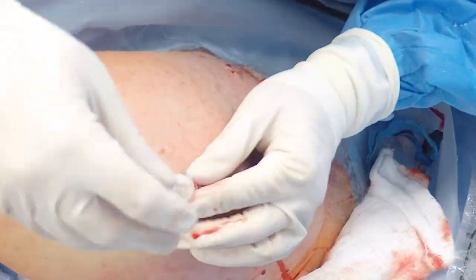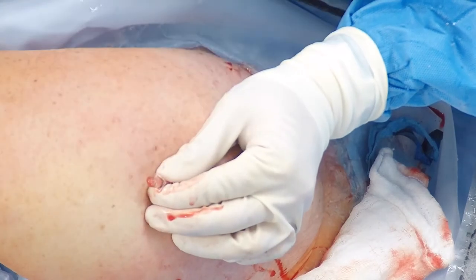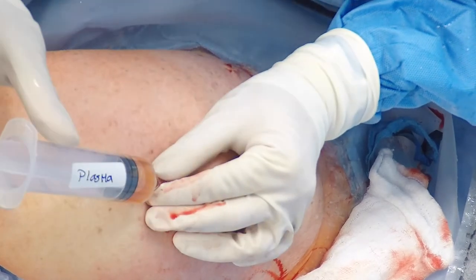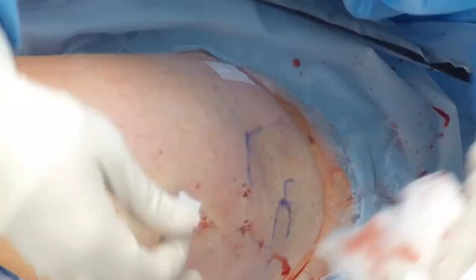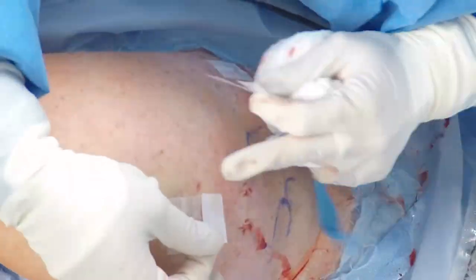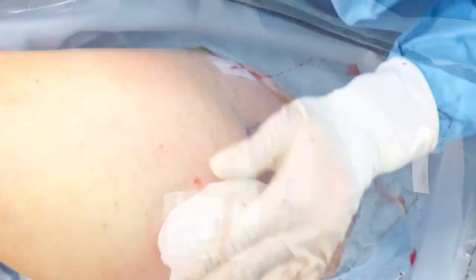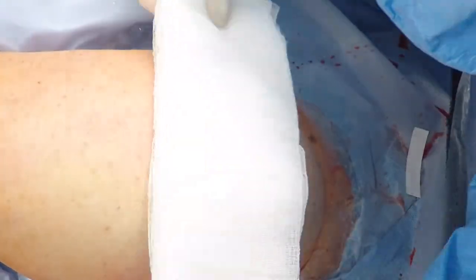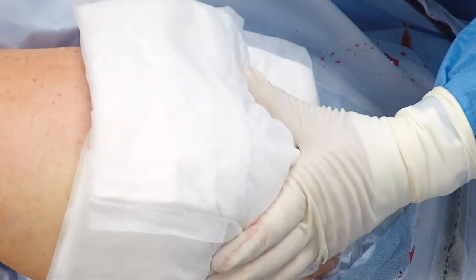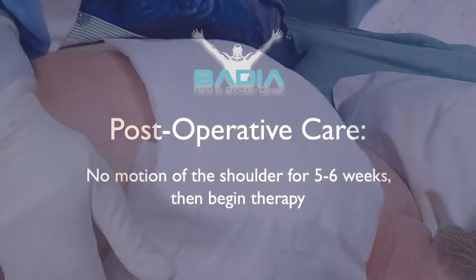We will also now inject a mixed connective tissue allograft at the juncture between the dermal allograft and the greater tuberosity, followed by platelet-rich plasma which we took from the patient's blood when his IV was inserted in the holding area. Sterile dressings are placed over zero form. A bulky dressing will be applied and the patient will be placed into a sling with an abduction pillow for patient comfort and also to minimize the tension on the SCR graft.